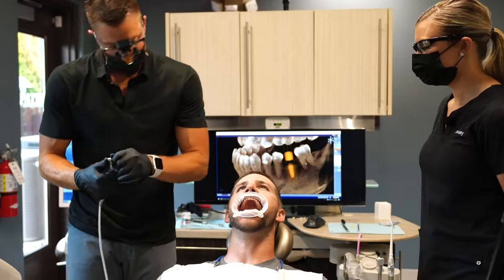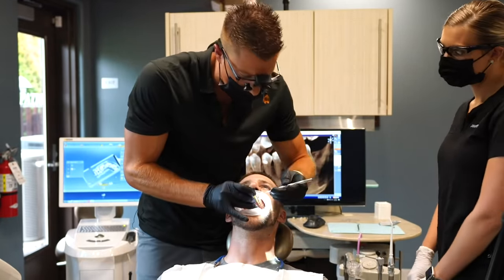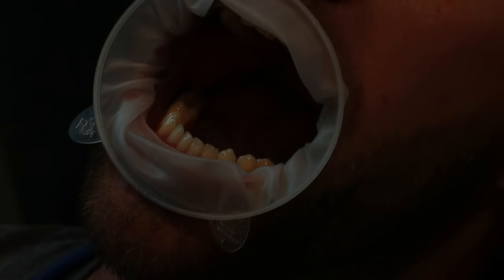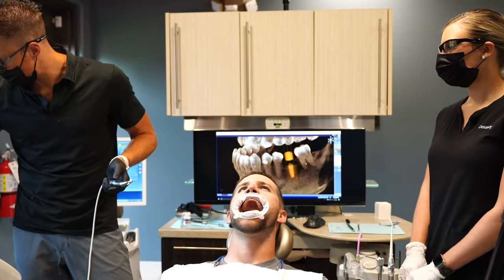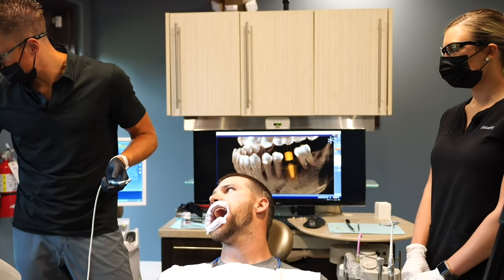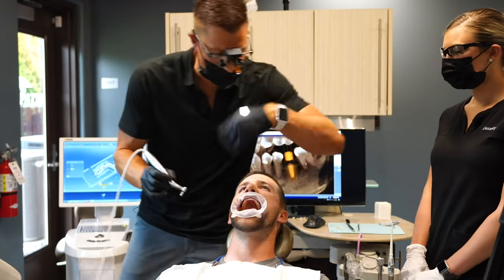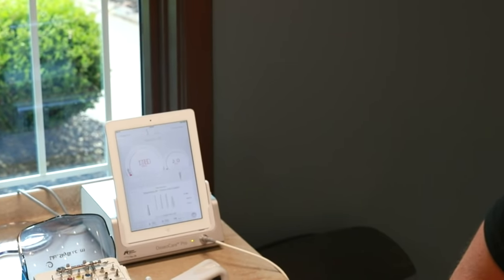So, now that we've got this on there and we know it fits right, we want to go ahead and make our little window in his gums. I can mark that very easily with some cavity dye. And in our software over here in our machine, I can tell it which implant we're placing, what size we're at, and it will program all of the components to operate at the right speed and torque and resistance. That gets rid of the guesswork, or at least manual corrections on your instruments.